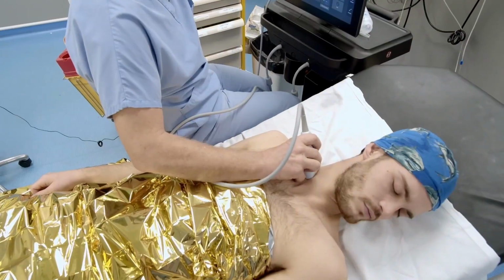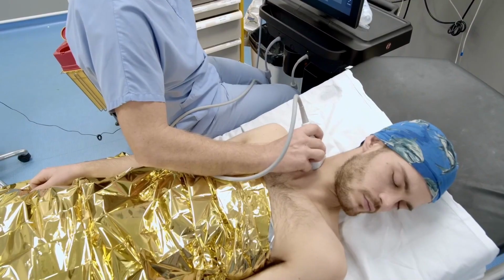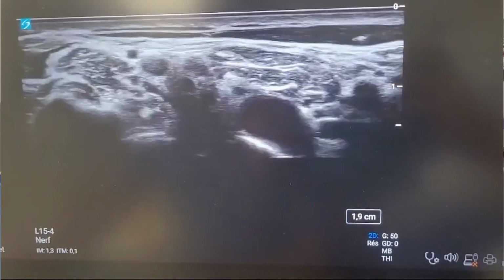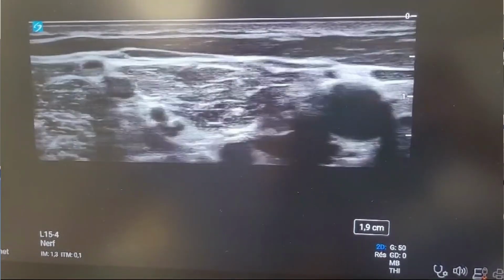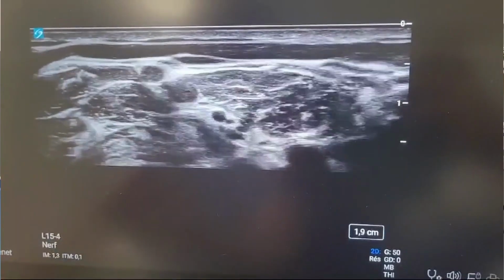The anterior scalene, okay? The middle scalene. Here we have the sternocleidomastoid. And so as you follow along a bit, you see here we have a slightly unusual configuration again, there you go, C5 and C6, all right? So by narrowing the field, we'll get better resolution. There you go, C5, C6, we find the anterior scalene, the middle scalene, okay?